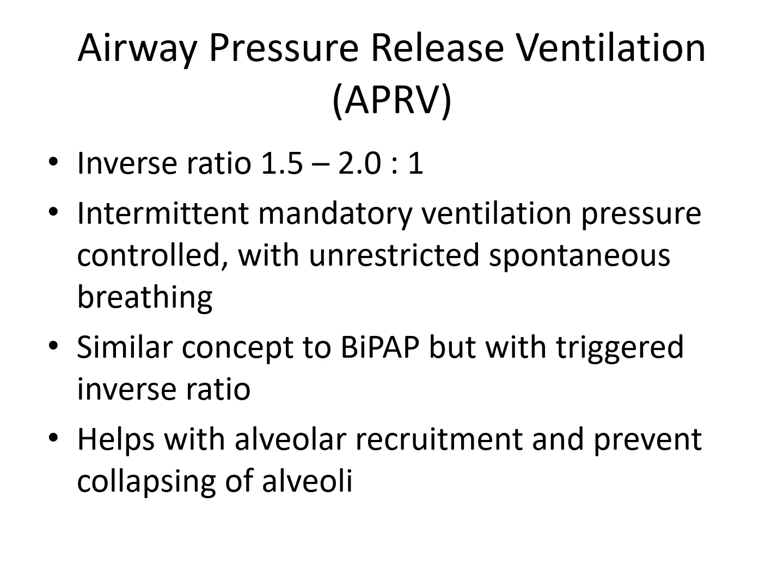It's similar to BiPAP's concept of different pressures for inspiratory and expiratory. Both modes allow unrestricted spontaneous breathing both during and between mandatory breaths, but there is more time for them to occur during the mandatory breaths with APRV. And again, APRV typically uses an extreme inverse I:E ratio, while BiPAP usually does not. So the spontaneous breathing can occur both during and between mandatory breaths, and like I said, the inverse ratio is what is different.